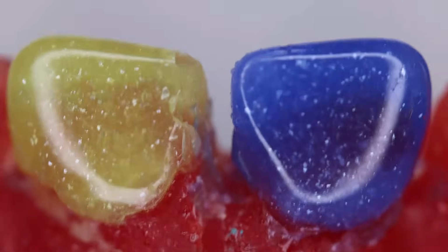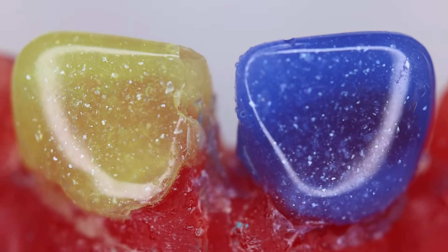So this is our blue tooth that is ready, the final crown.